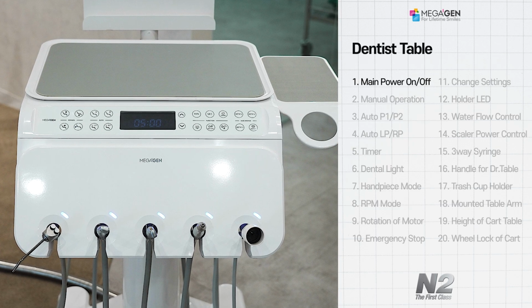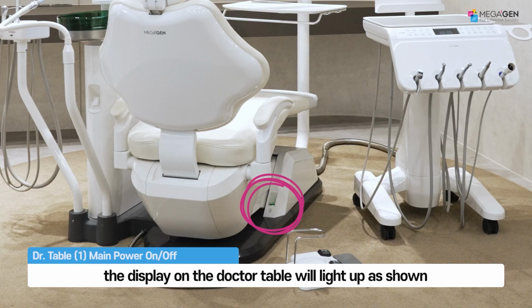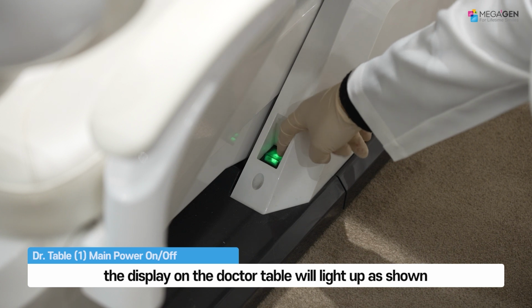How to use dentist table. First, when you turn on the chair's main power, the display on the doctor table will light up as shown.